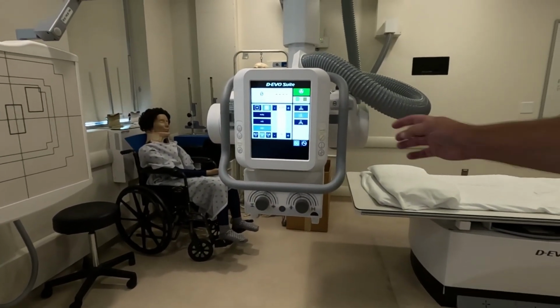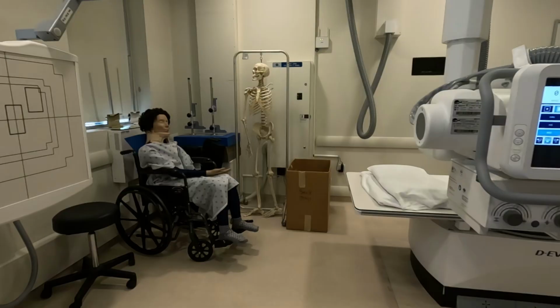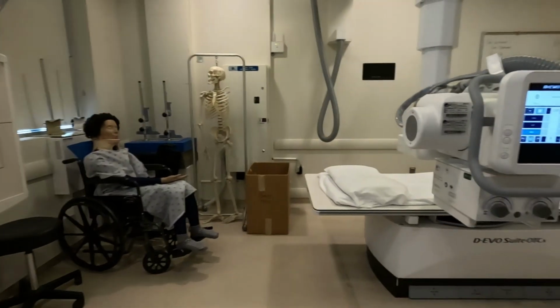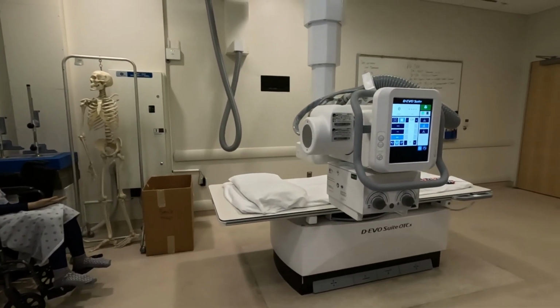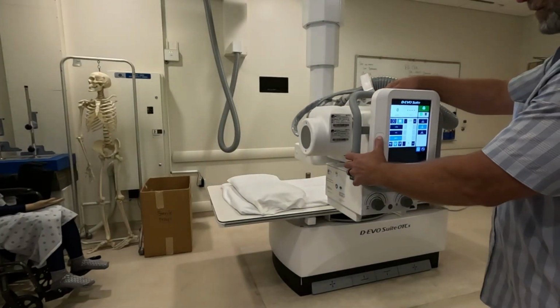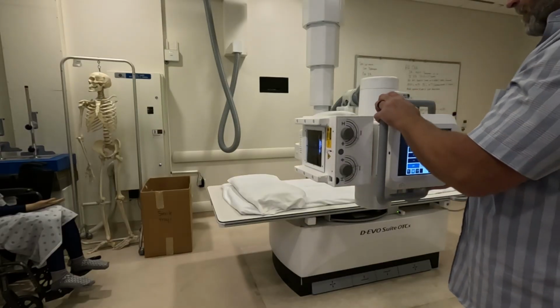So let's back it back up to 72 inches. And sometimes getting it out of detent needs some hesitation. So we're locked back in at 72 inches here. So since we're doing a chest x-ray, we want to shoot into the wall bucky. So not only would I lock it into the preferred detent, but I would also turn my x-ray tube so that it's pointing at the wall bucky.